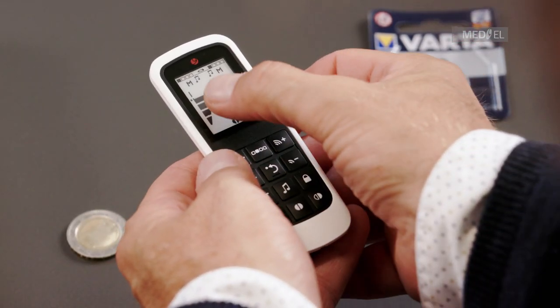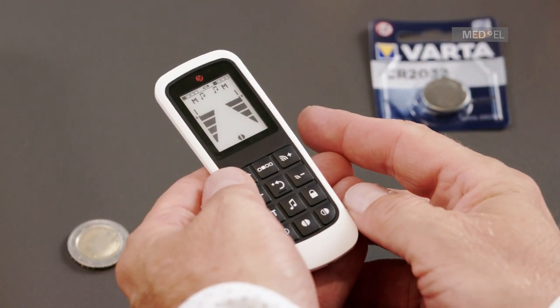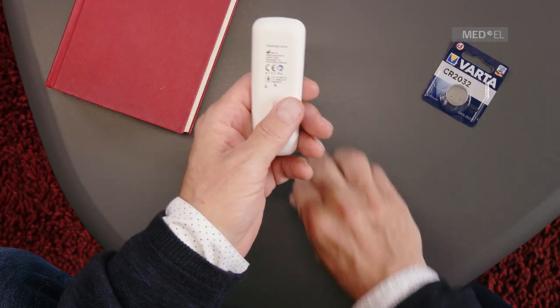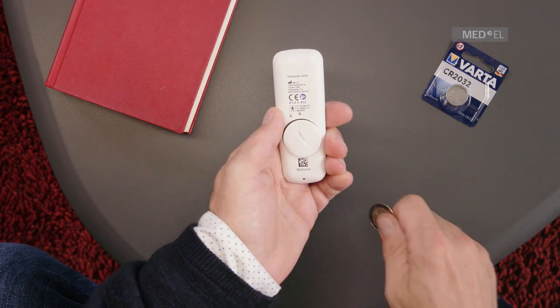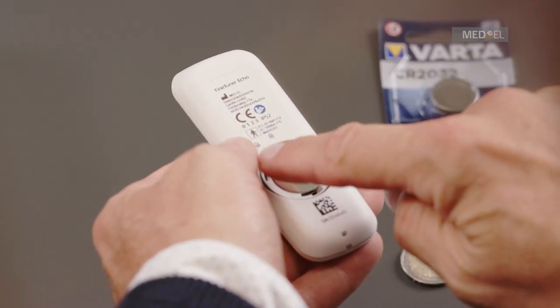If you see a horizontal battery symbol at the top of the screen, the fine-tuner echo battery is running low. Using a large coin, turn the battery compartment cover until it points to the unlocked symbol. Carefully remove the cover, making sure the black silicone ring does not fall out.